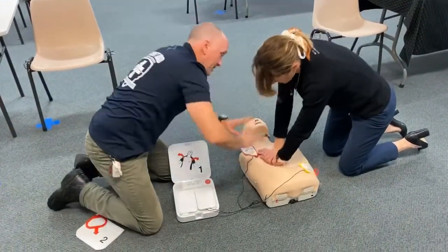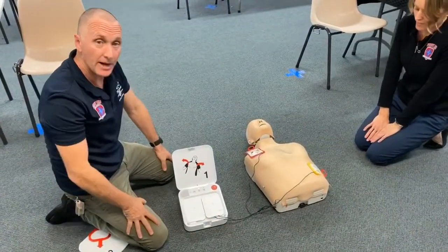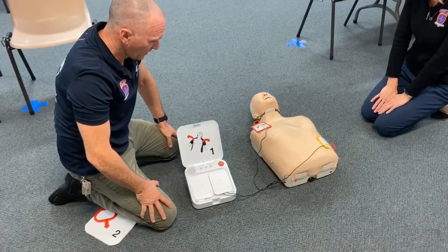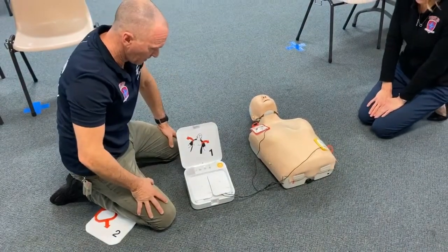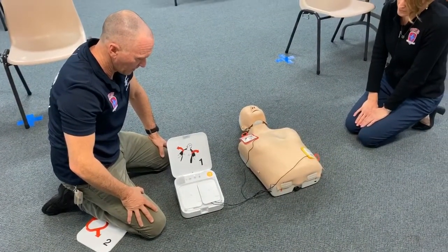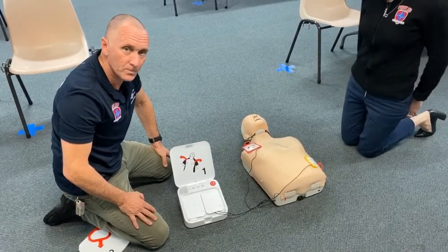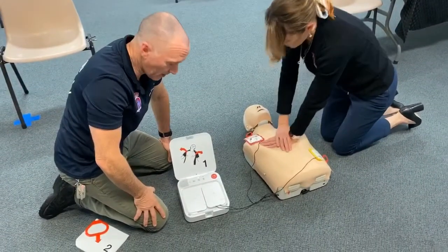Do not touch patient. Everyone stand clear. The defibrillator will analyze the heart rhythm. Everyone clear — do not touch patient. Delivering shock. Shock delivered. Provide chest compressions. Continue CPR — the heel of one hand should be in the centre.